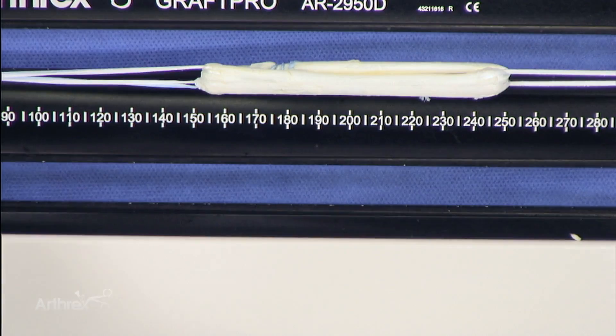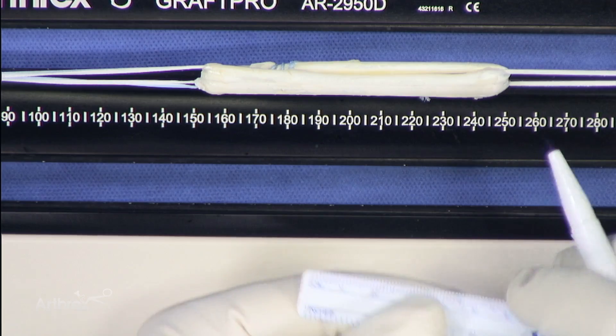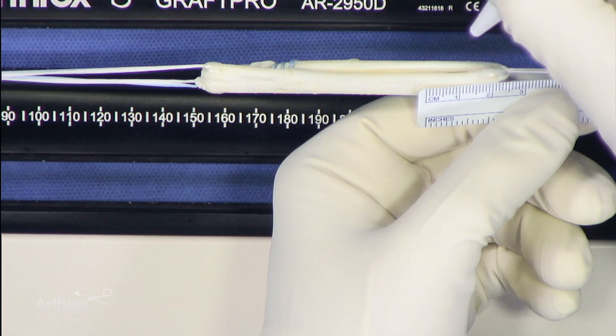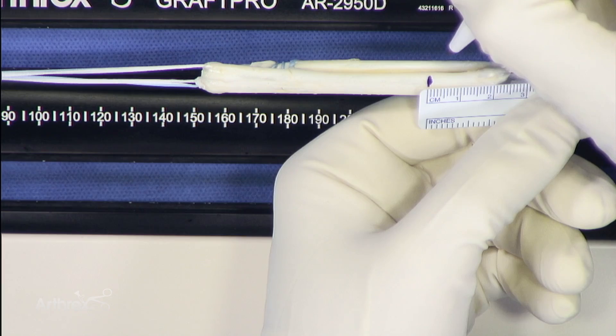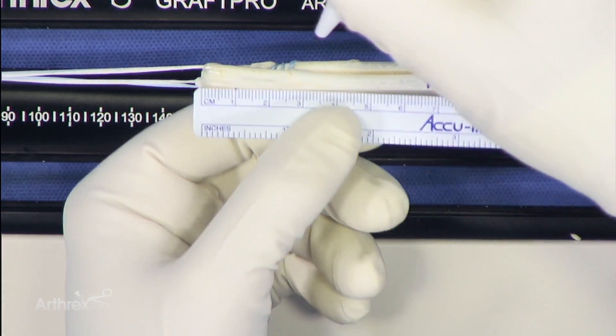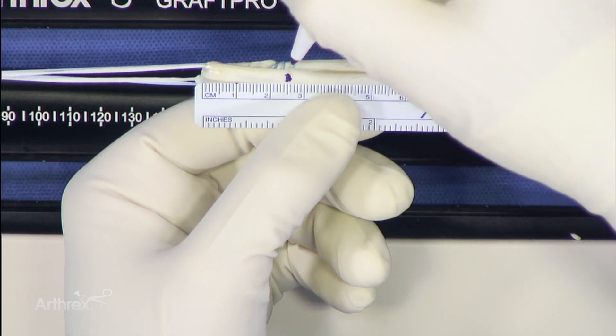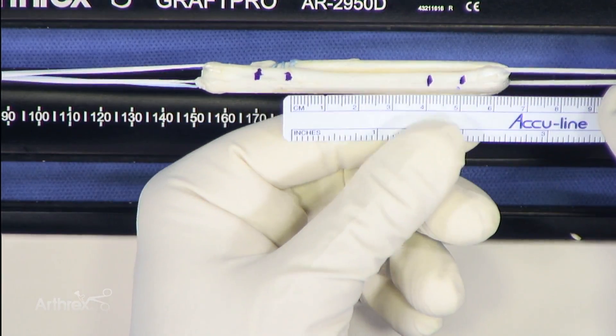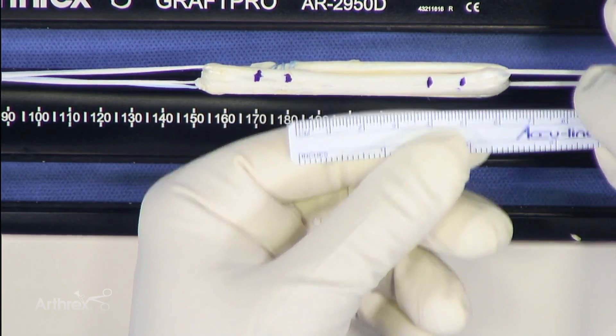For the ACLs, we normally go 20 millimeters in the sockets. For the PCLs, we normally like to go 25. So here I'm going to mark it at 25 and then at 15. And I'll do the same thing here, 25 and 15. And you can see that this is our total intra-articular distance.